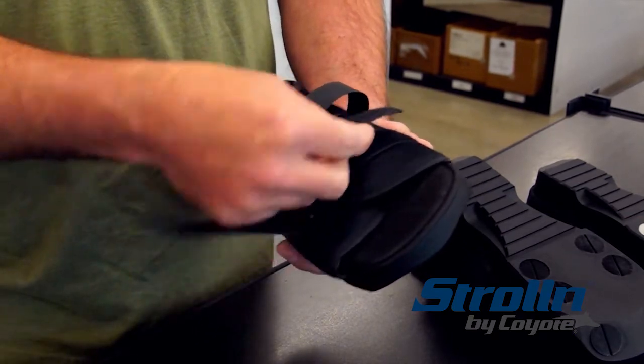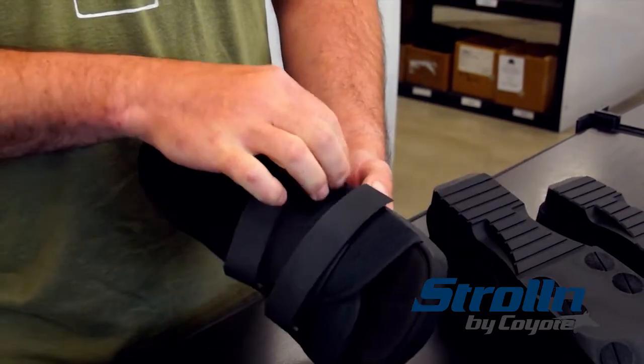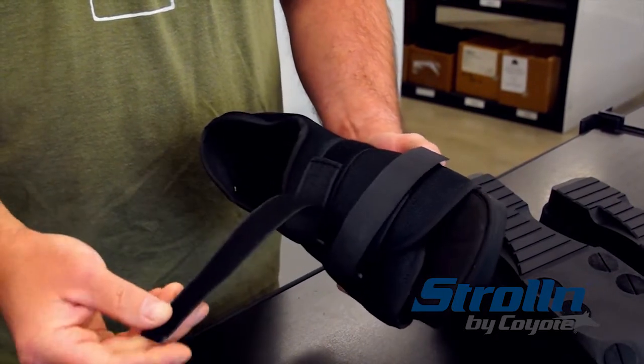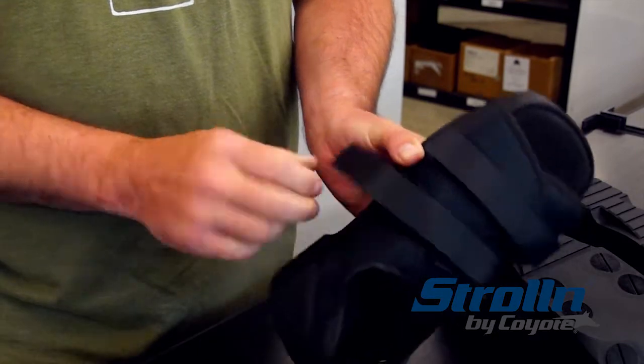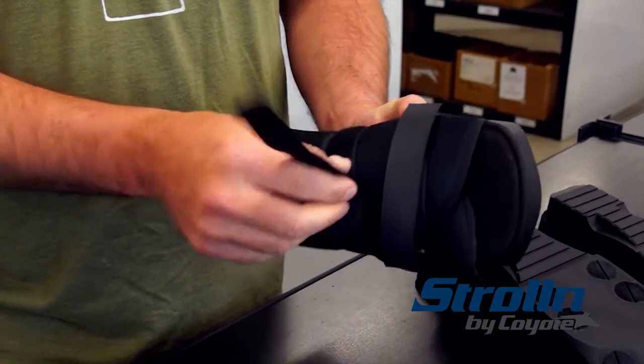The other thing you want to be able to do is, once you fit it to your patient and you like where it's at, you can also trim the Velcro straps with a pair of scissors so that they're not hanging way out. So feel free to trim those once you got your size down.